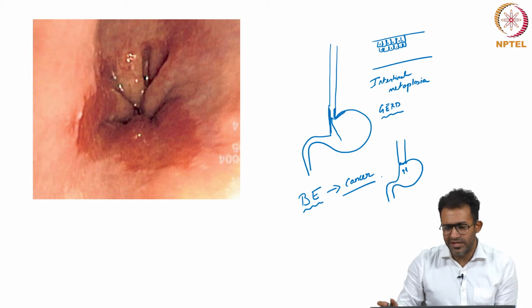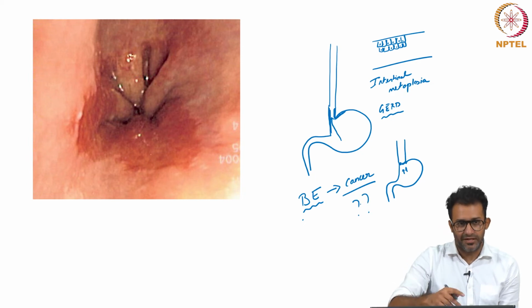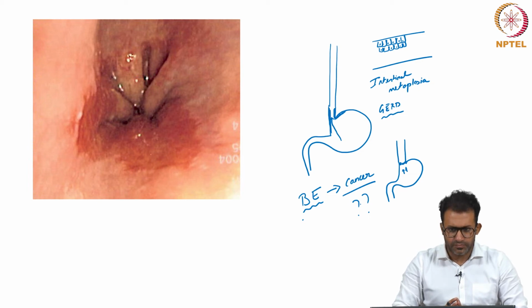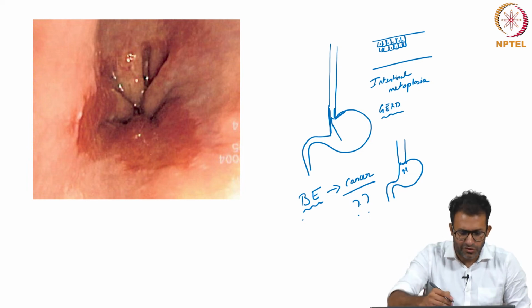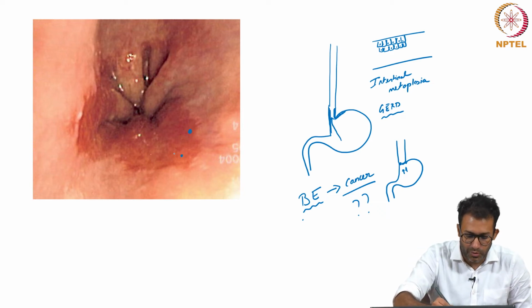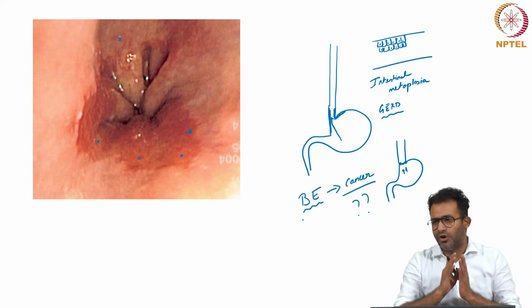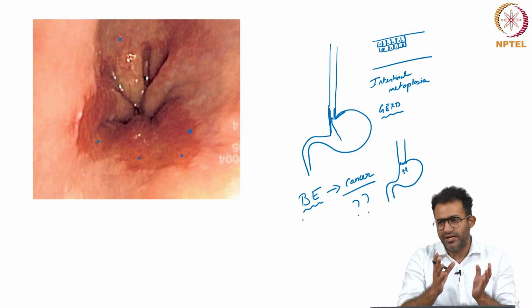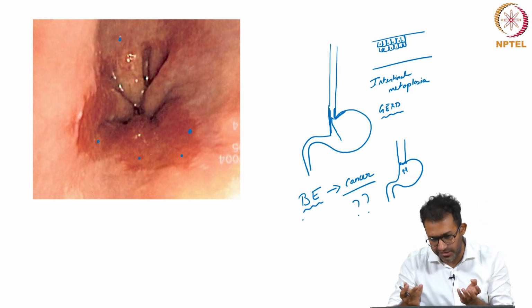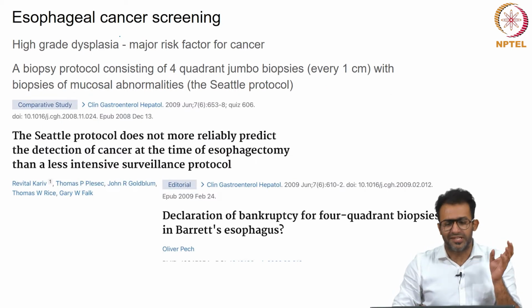So, how do you know whether it is Barrett's esophagus or whether it is cancer? You look at this particular image: how do I know which part could be cancer? The cancer could be over here, it grows as a small thing, it could be over here, or over here. Honestly, looking at this particular image, I am not able to find out where this Barrett's esophagus could have cancer. And to understand that, they have devised something called the Seattle protocol.